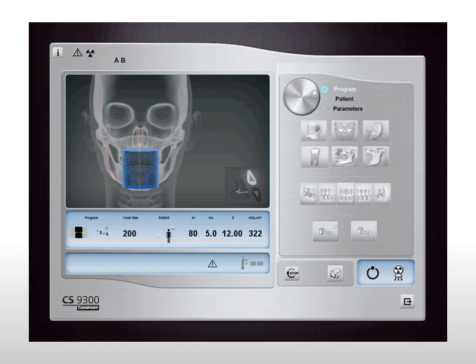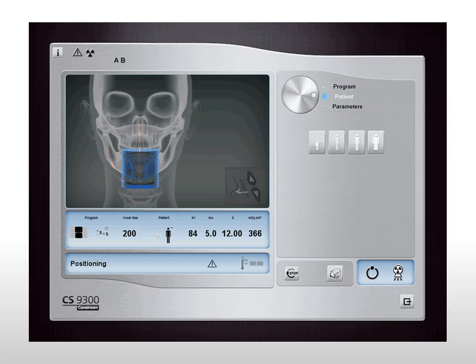Now it's your turn. In the 3D acquisition window, select the teeth focus program pane option. Select the anterior teeth to be included in the exam. Select the 5x5 fast acquisition button. Select patient size medium.